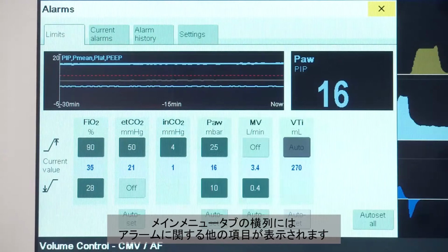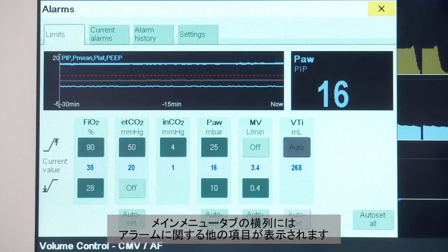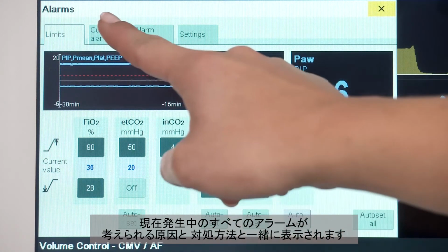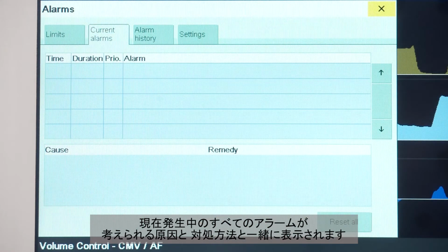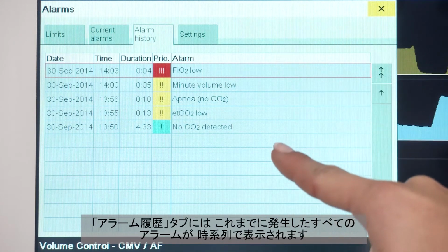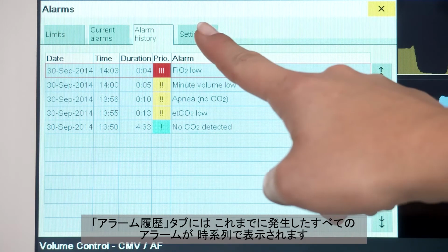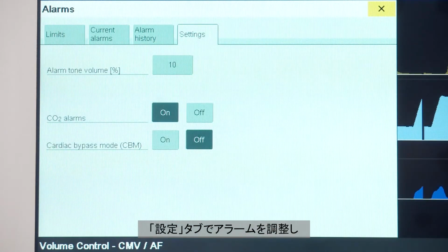Next to the main menu tab, Limits, you will find additional tabs regarding alarms. You can view all current alarms, including their respective possible causes and remedies. The Alarm History tab lists all alarms that have occurred in chronological order. The Settings tab allows you to adjust the alarm volume.